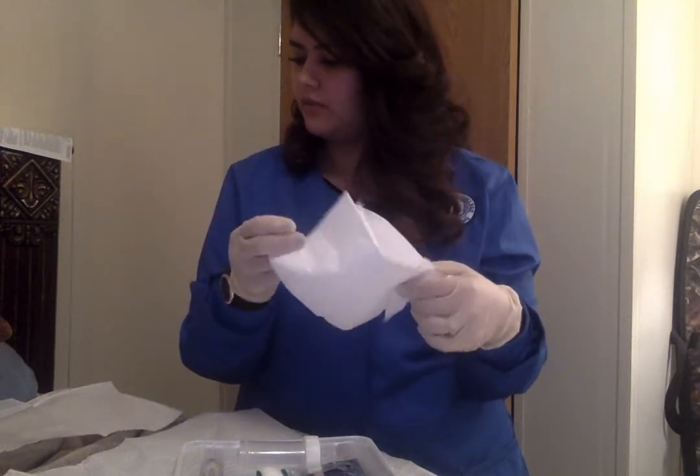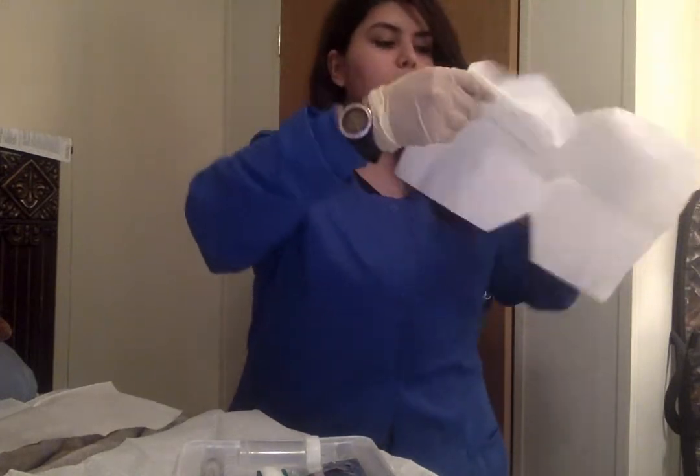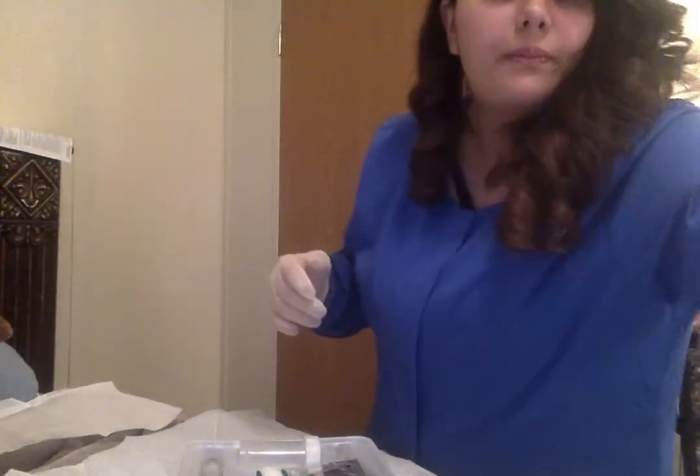Why do we have two of these? Oh, because this one was for the boy. Okay, we don't need this one. We're getting rid of this.